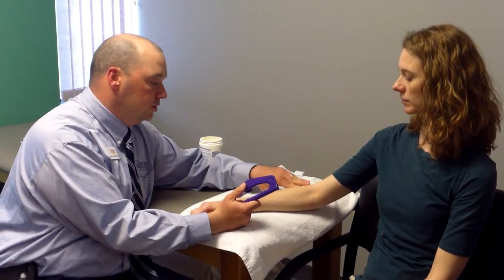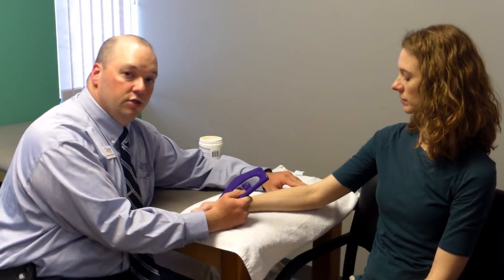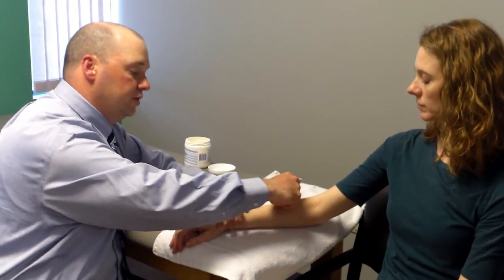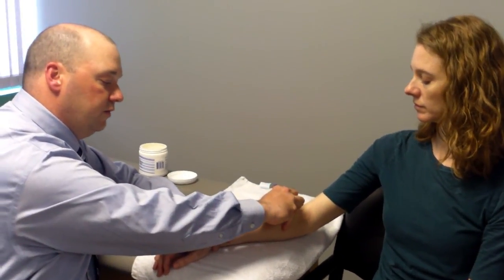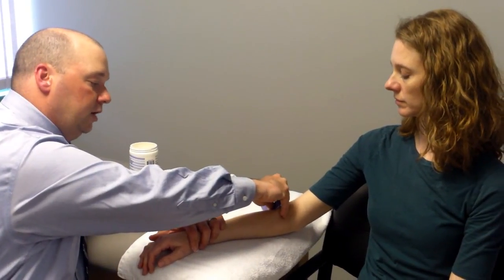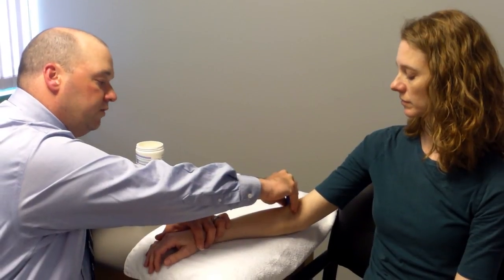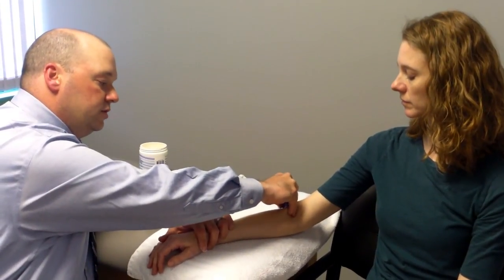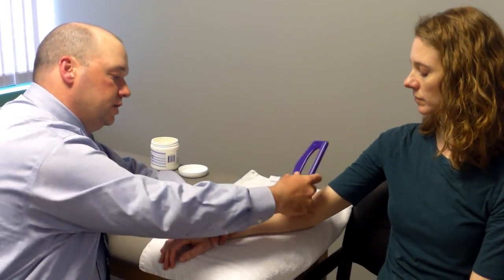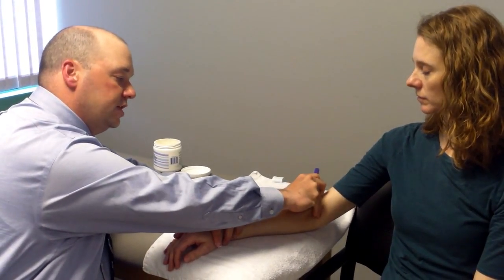In just a few moments, I'll be demonstrating a treatment technique on an actual patient. What we're going to do is treat Chris's lateral epicondyle here. She's had a bit of tennis elbow. So we're going to use the larger tool to search through the muscle and find maybe some areas of fibrotic tissue or scar tissue. As we do, we can feel some knotting or clicking in there, and Chris can probably feel that too. And once we find those areas where we are experiencing that fibrotic tissue, we use this tool to locate or to start and scan with.